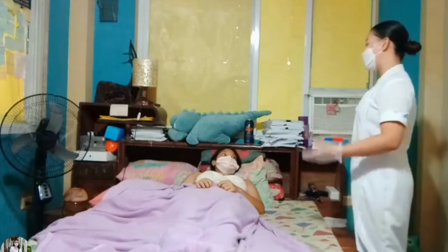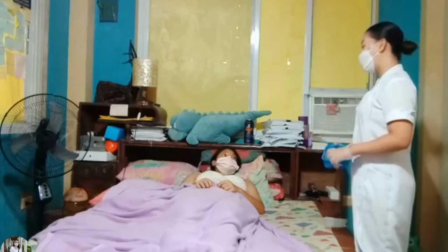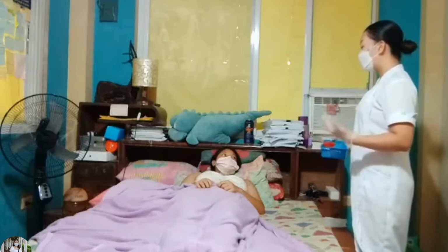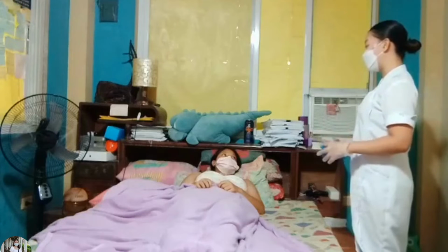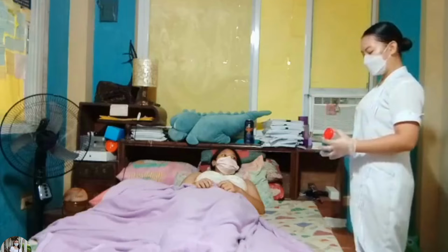Ask the client to breathe deeply and then cough up 1 to 2 teaspoons or 4 to 10 ml of sputum. For acid-fast bacillus or AFB, which also requires collection, often for 3 consecutive days, this is to identify the presence of tuberculosis or TB. If the client produces sputum, open the lid of the container and then have the client expectorate the specimen into the container. Follow special precautions if tuberculosis is suspected.